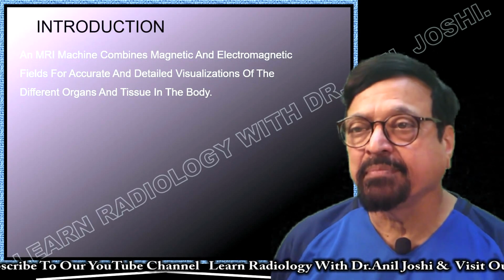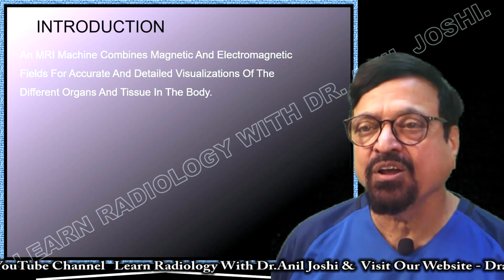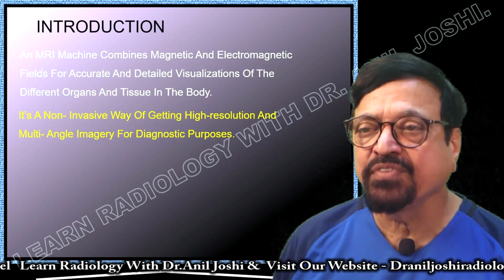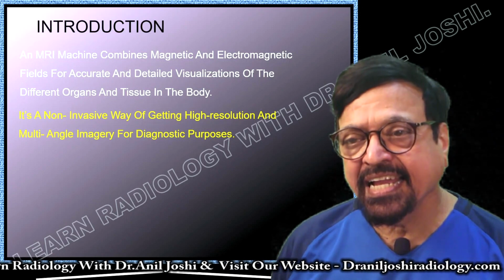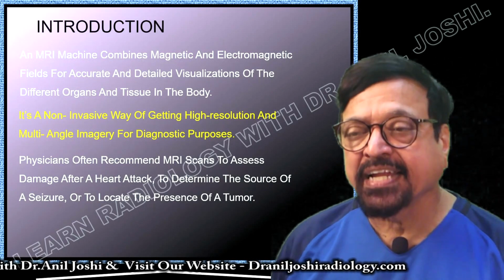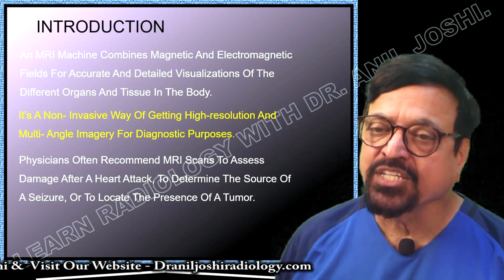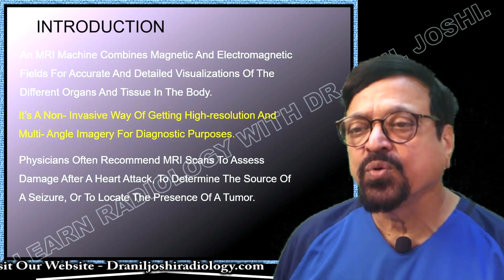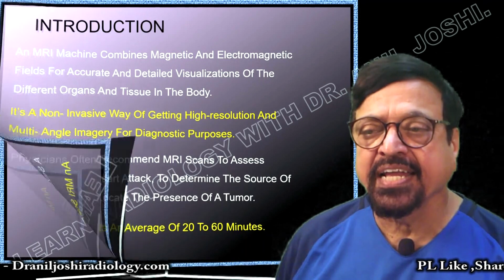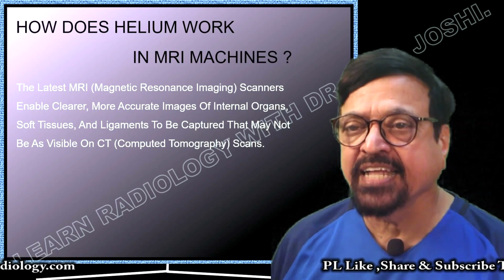An MRI machine combines magnetic and electromagnetic fields for accurate and detailed visualization of different organs and tissues in the body. It is a non-invasive way of getting high resolution and multi-angle imagery for diagnostic purposes. Physicians often recommend an MRI scan to assess the damage after a heart attack, to determine the source of seizures, or to locate the presence of a tumor. There are also multiple other indications, which we have covered in some other lecture. Do visit our website or our YouTube channel for all these things.